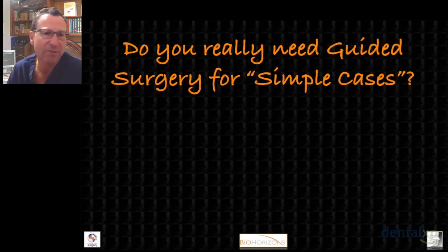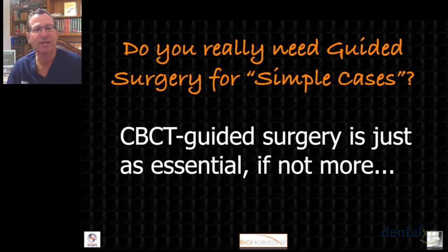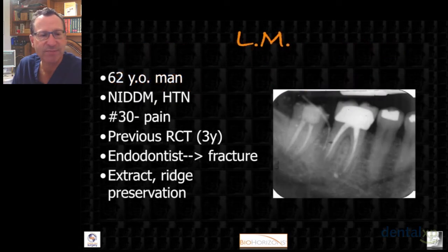If you're doing multiple units, you actually have a little bit more leeway, and if you're doing a fully edentulous case, even more. So I think there's no such thing as a simple case, and I think for these so-called simple cases, guided surgery is even more essential than it is for some of the bigger cases.